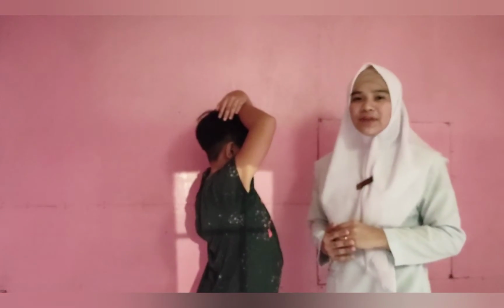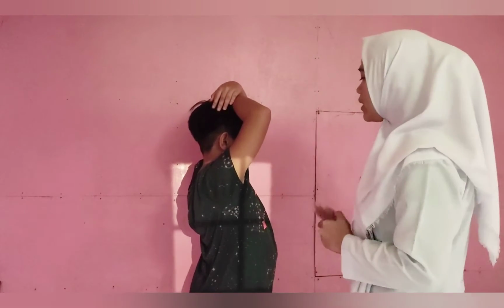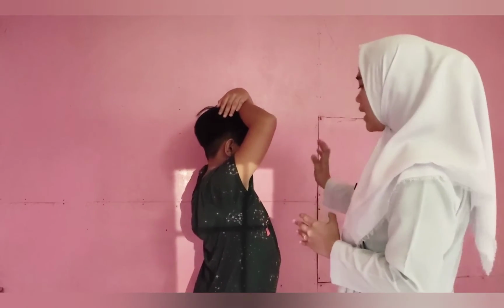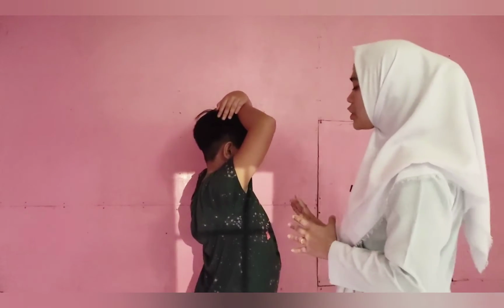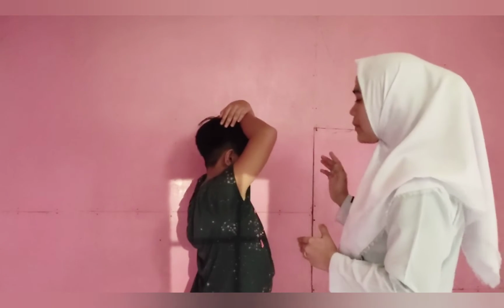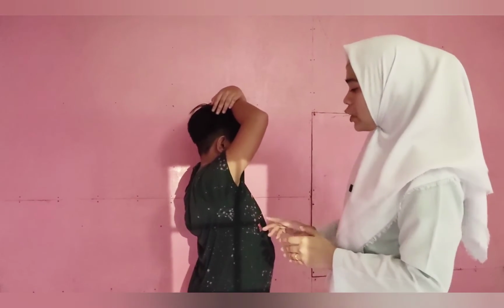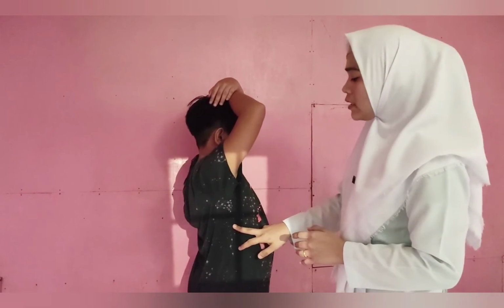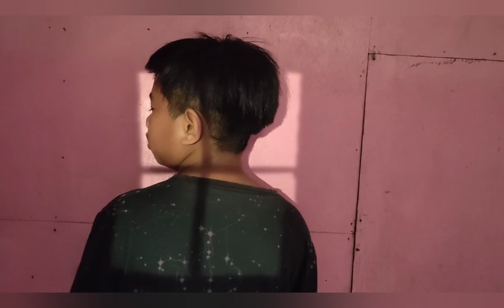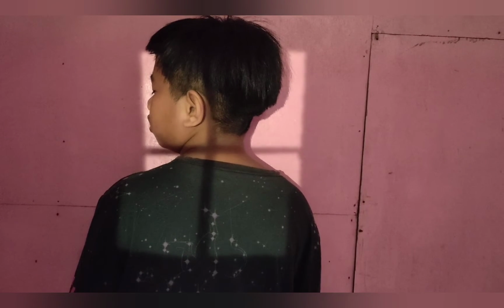So this one is the lateral projection of chest. Patient erect with left side against the IR. Then position the patient in lateral with arms raised above their head. Then CR is perpendicular to IR, directed to mid-thorax.